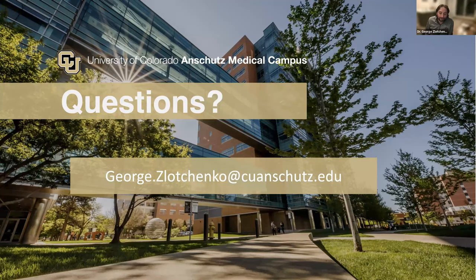Oh, great. That's another great question. That's actually kind of difficult. When I first started the perfected technique, it was very difficult because I would go to stasis of the intraprostatic arteries, and then it would be much more difficult to advance the microcatheter. But with more experience, I go to almost stasis. We talk about this 5 to 6 beat stasis endpoint, so maybe you want to go to like 7 to 8 beats and then advance the catheter. You want to end a little bit earlier than you would for a uterine fibroid embolization to be able to advance that catheter and have enough flow to get more embolic in there. But it is challenging. That's a good question. It comes more with experience.